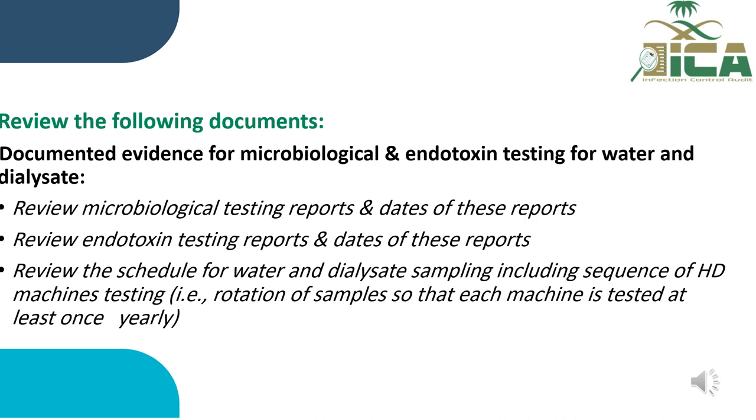Review the following documents: documented evidence for microbiological and endotoxin testing for water and dialysate. Review microbiological testing reports and the dates of these reports. Review endotoxin testing reports and dates of these reports. Review the schedule for water and dialysate sampling, including sequence of hemodialysis machines testing.